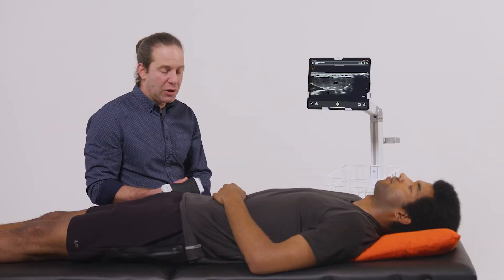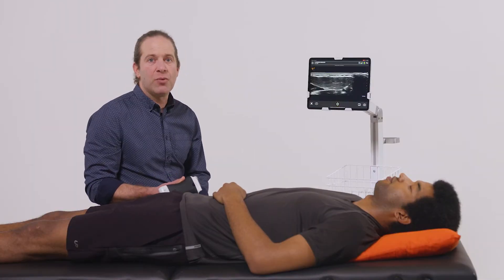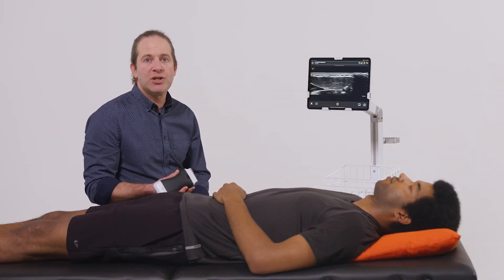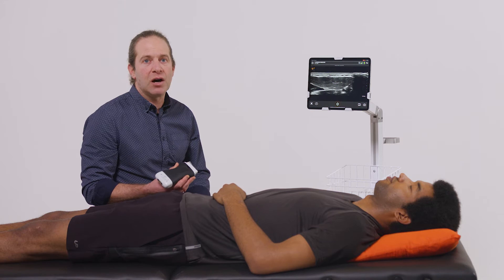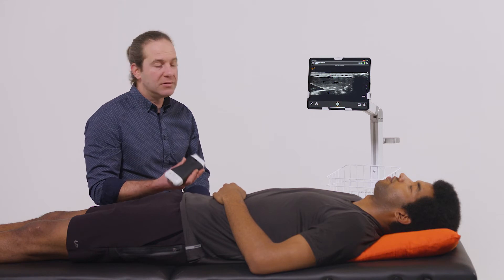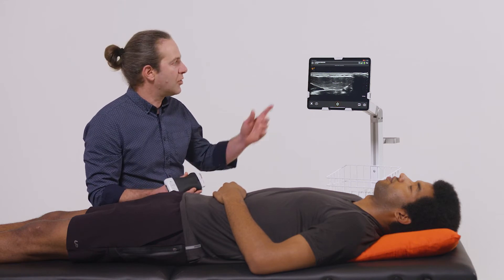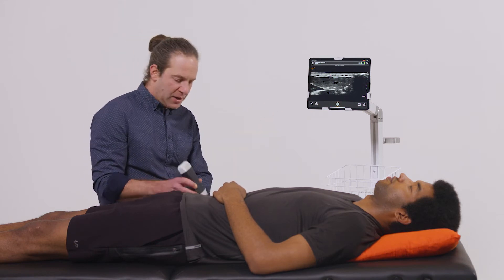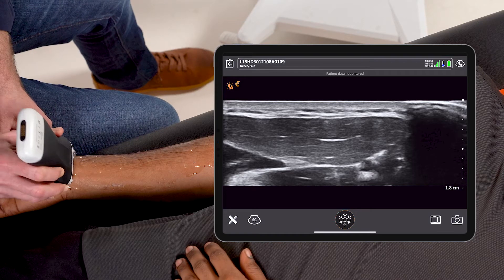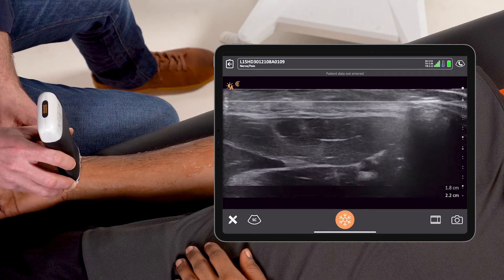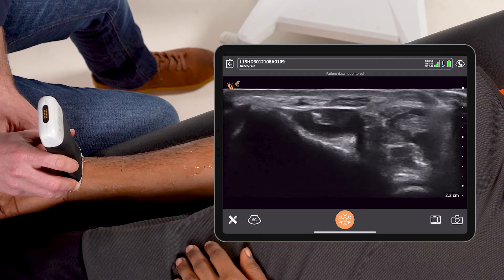In this example I'll show how to find the radial nerve in preparation for a radial nerve block. I'm using a linear scanner on the nerve setting and I'll place the transducer in the transverse orientation here.